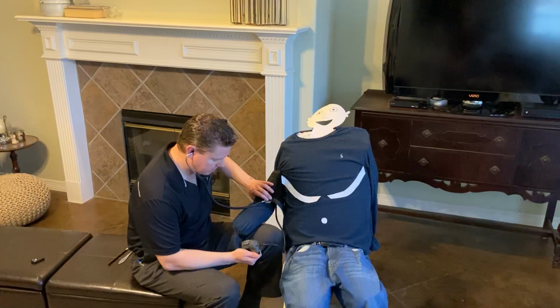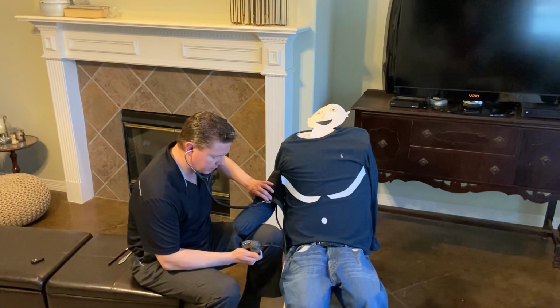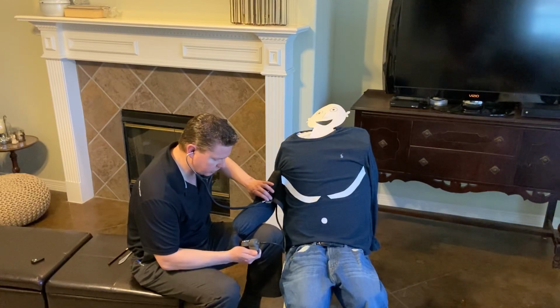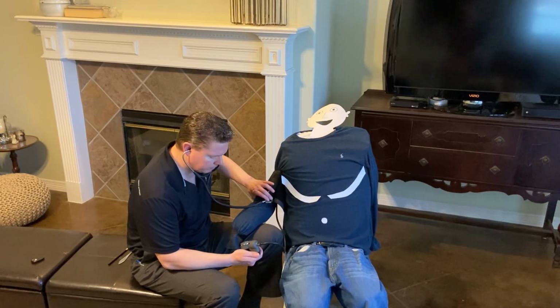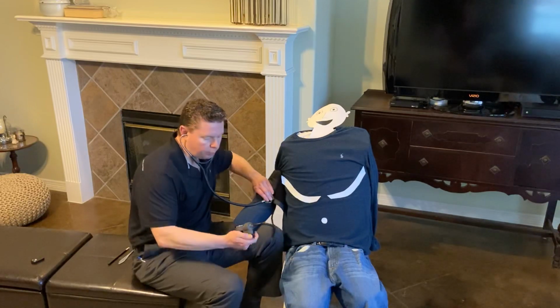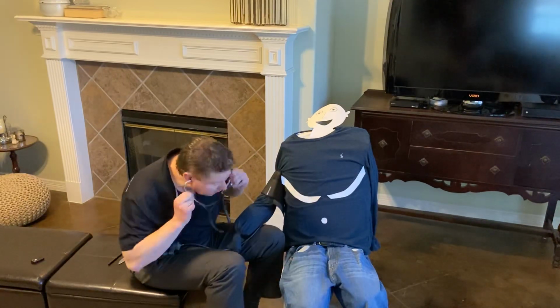When I get there, I'll release pressure slowly at about 3 millimeters of mercury per second until I get my reading, and I'll report my reading in even numbers.